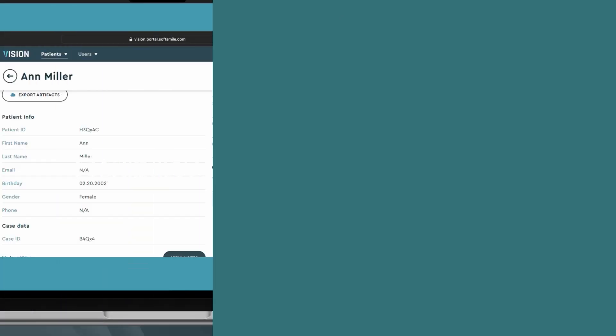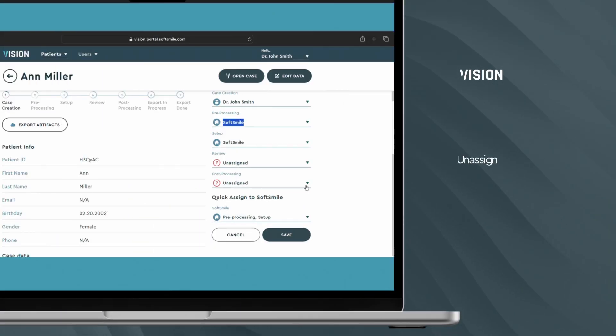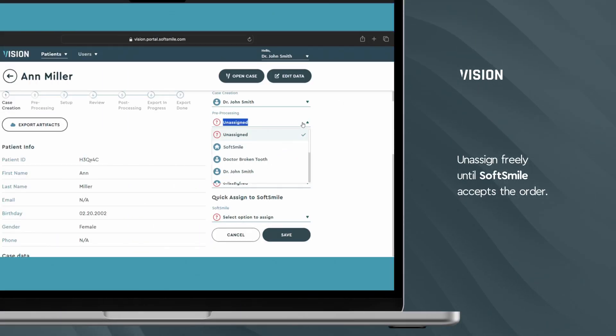Until a SoftSmile administrator accepts the order, you have the flexibility to make changes or unassign as needed.